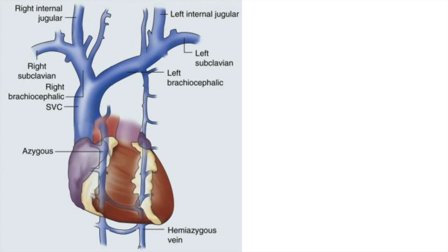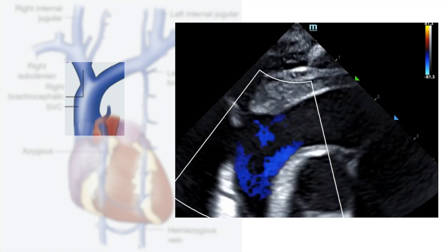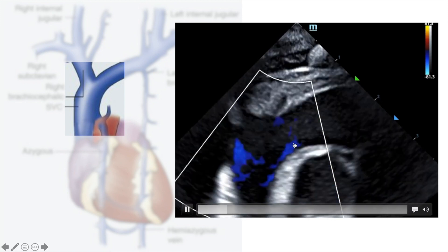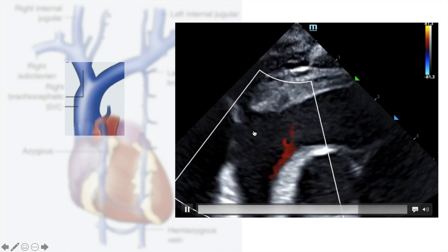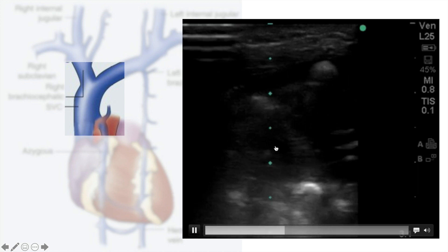For upper limb PICC lines it's a little more complicated. As a refresher on the anatomy: the left brachiocephalic joins the right brachiocephalic, and together they form the SVC, which drains into the right atrium. Here is the ultrasound view — the left brachiocephalic coming from one side, the right brachiocephalic from the other, and the SVC in the middle.